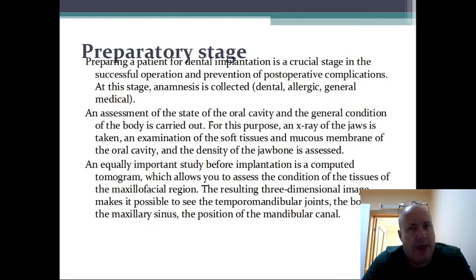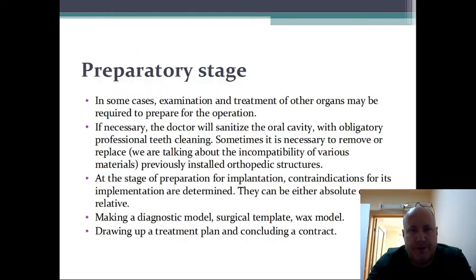At this stage, anamnesis is collected, and an assessment of the state of the oral cavity and general condition of the body is carried out. An equally important study before implantation is a computer tomography, which allows you to assess the condition of the tissues of the maxillofacial region.